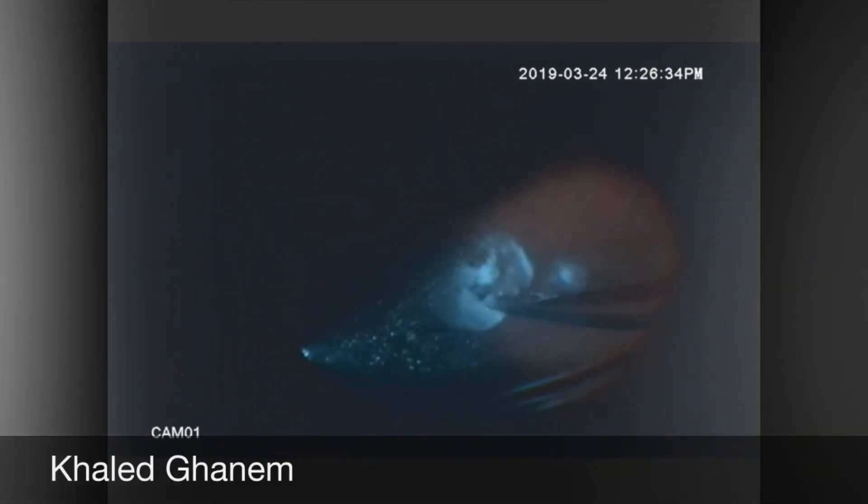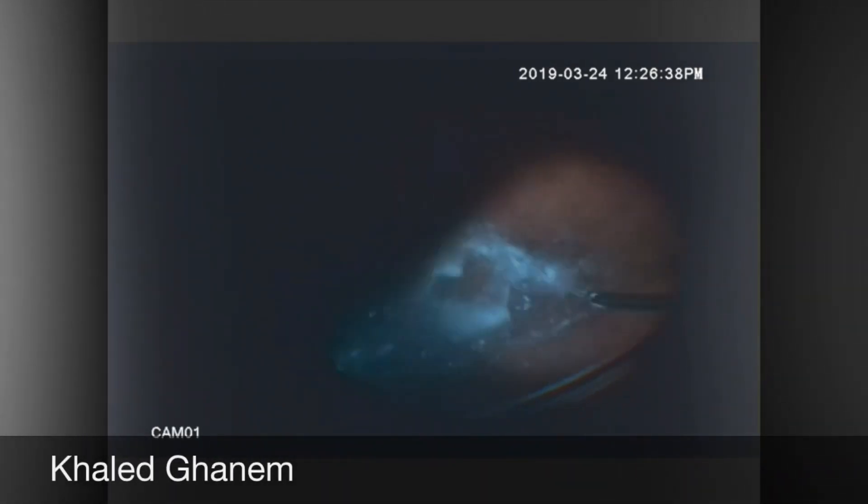First, a complete vitrectomy should be done. PMMA is a large rigid IOL with very sharp haptics, so you should remove all the vitreous that is entangled around the IOL to make it freely mobile and avoid any adherent retinal tears.